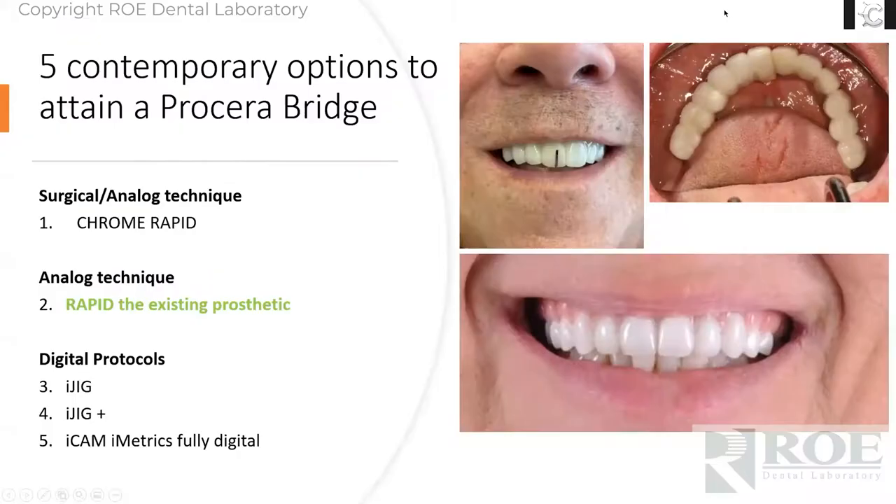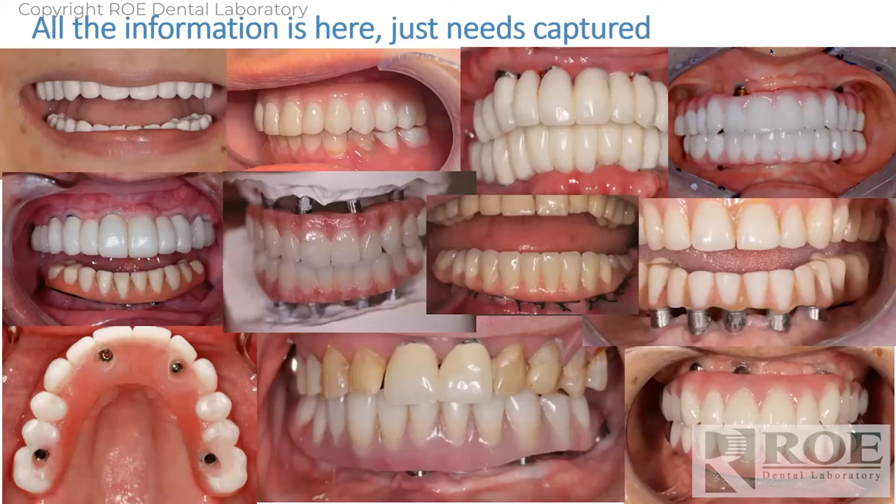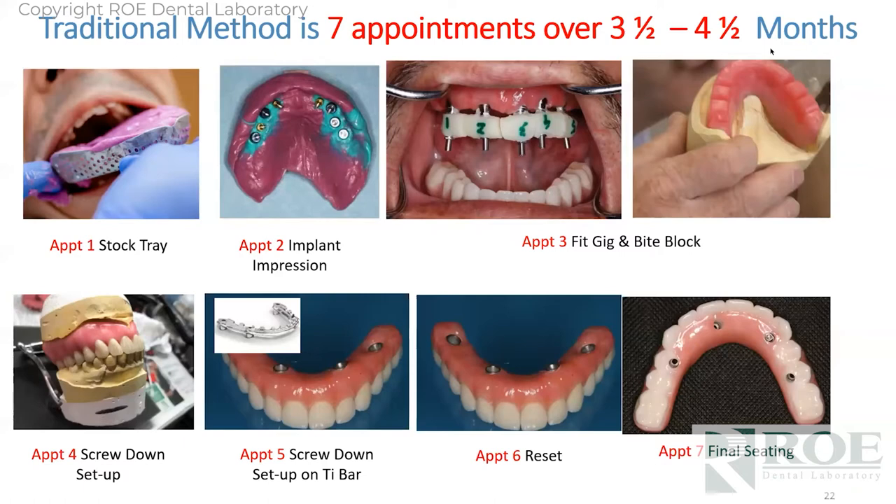The next one is the rapid appliance with an existing prosthetic. The rapid appliance is either from the surgical protocol or we do a delayed method — a patient walks in with a prosthetic that needs to be redone. Look how far the midline is off in these images. Patient has a gummy smile on the lower one — it's an FP1 on the upper. It works best at MUA level. Patient comes in with just about any situation, and why did we develop the rapid appliance technique? Because the traditional methods are tedious, to say the least.